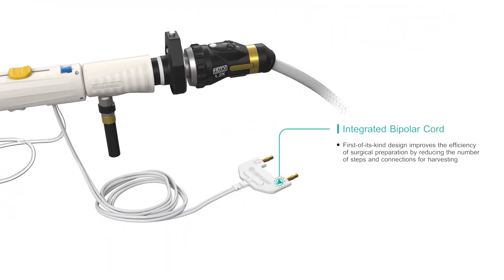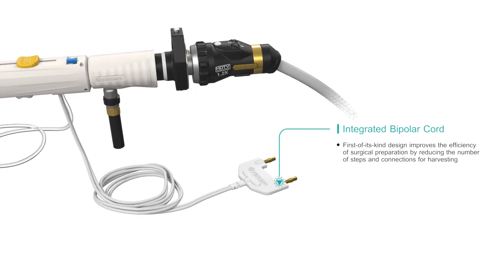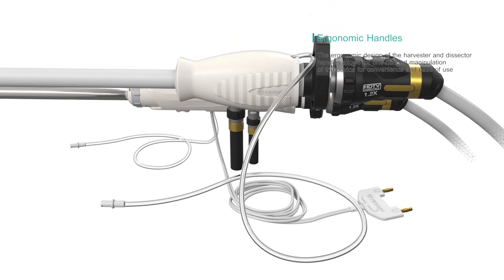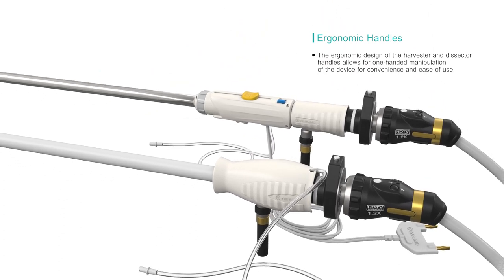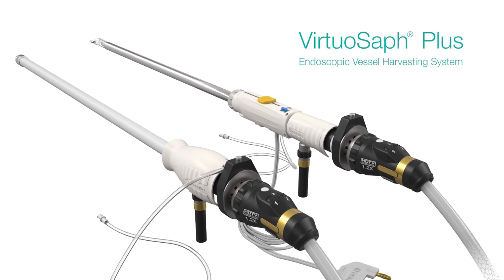The VirtuOSAF Plus's integrated bipolar cord is fully integrated into the harvester rod. The ergonomic handle on the VirtuOSAF Plus has a unique design that makes it easy to use and is designed to reduce the potential for hand strain.